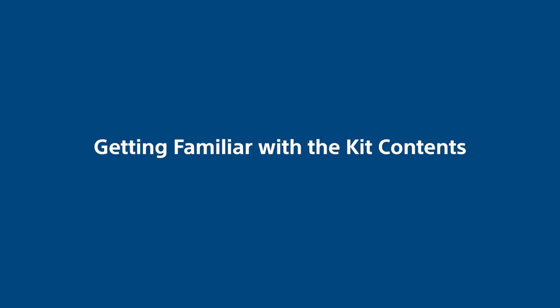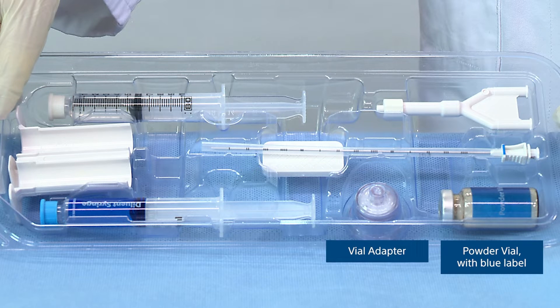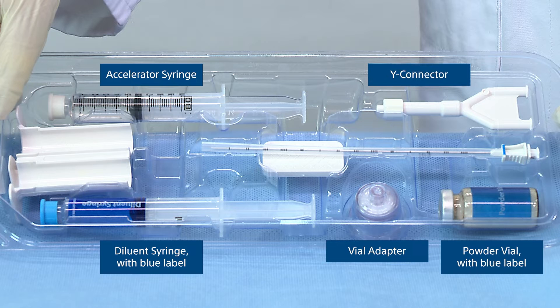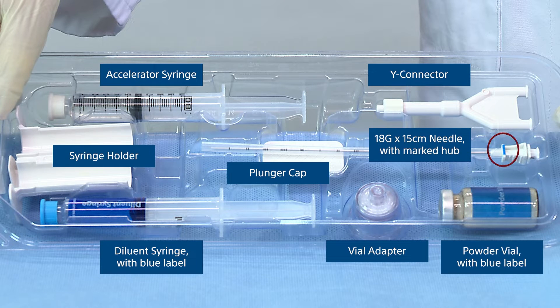Getting familiar with the kit contents: powder vial with blue label, vial adapter, diluent syringe with blue label, accelerator syringe, Y connector, syringe holder, plunger cap, and 18 gauge by 15 cm needle with marked hub.